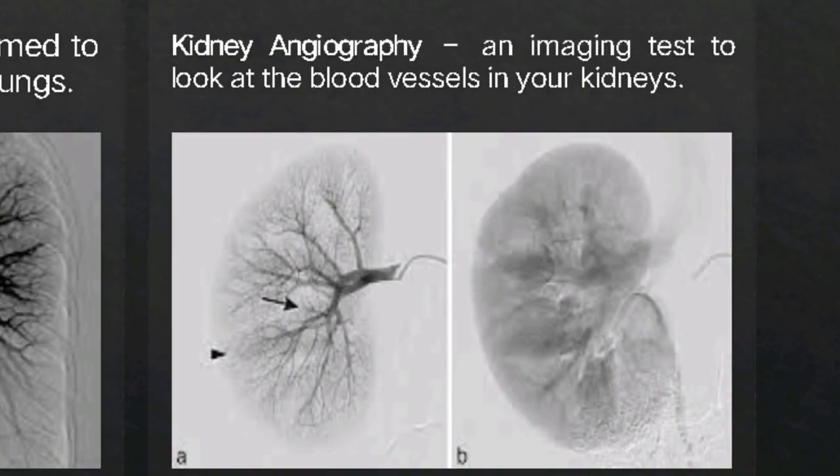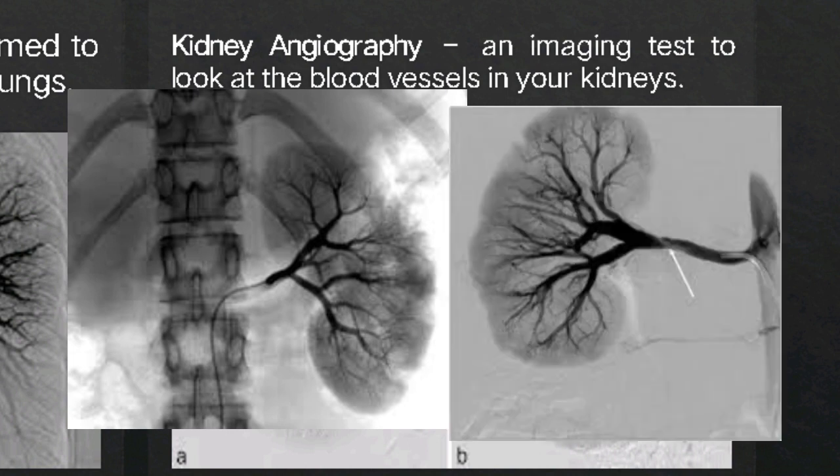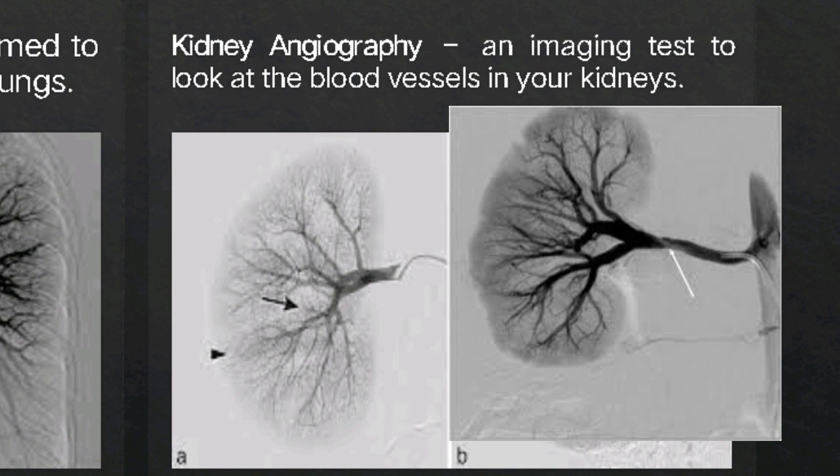Kidney angiography. Patients with chronic renal disease or injury can suffer further damage to their kidneys from the contrast medium used in a kidney angiogram. Yet, they often require the test to evaluate kidney function. These patients should be well hydrated with the intravenous saline drip before the procedure and may benefit from available medications like dopamine that help to protect the kidney from further injury due to contrast agents.